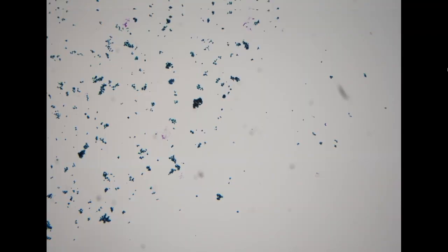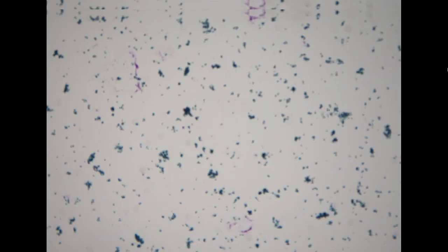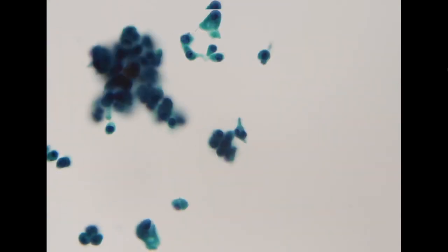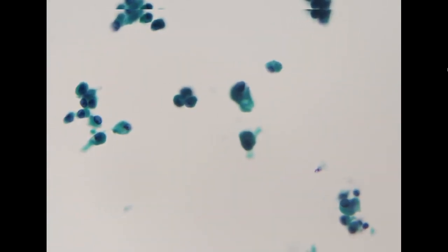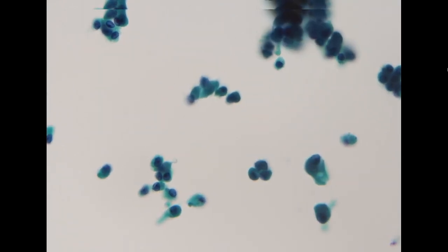So let's move to some of the fine needle aspiration findings. This is a case that we discussed last Friday from the thyroid. We discussed the differential diagnosis with this particular morphology, like loosely cohesive single cells, a lot of them showing eccentric plasmacytoid features, and we need to think about the possibility of medullary thyroid carcinoma.